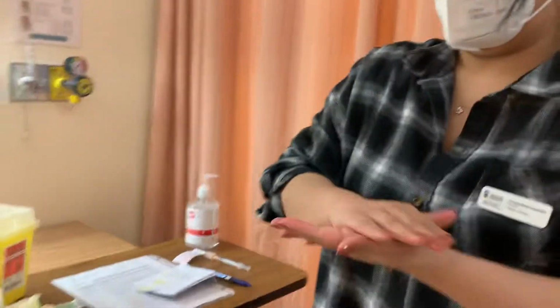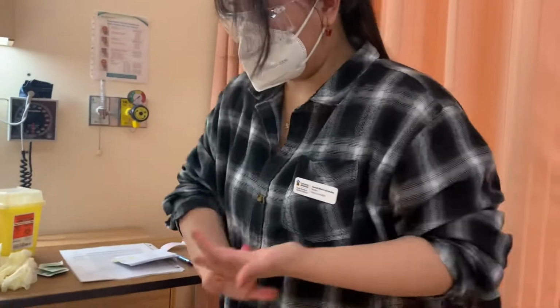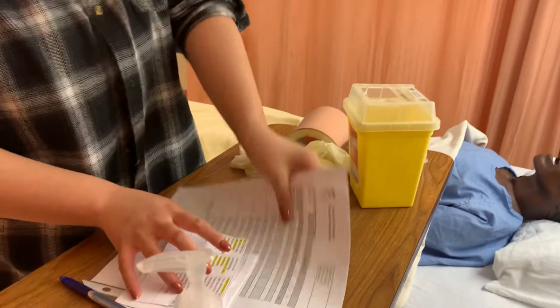First, I'm gonna wash my hands. Hello, my name is Jannah, and I am a nursing student. I'm gonna do a quick safety check here, and I wash my hands. No hazards on the floor. Perfect. So I'm gonna first verify the patient.